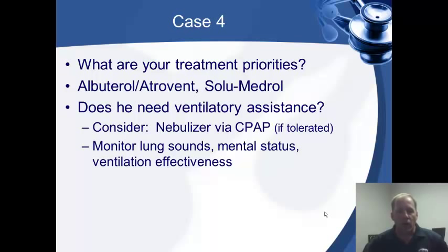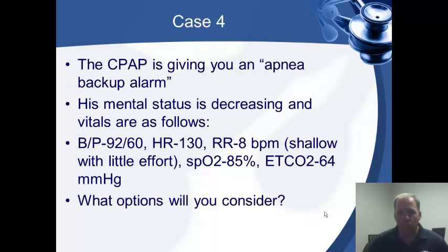You want to monitor lung sounds, mental status, and ventilation effectiveness so that we know whether we need to continue this treatment or become more aggressive. Once the patient's very tolerant of the mask, then we can strap it on their head and just continue to coach them while the mask is in place. So if the CPAP starts giving you an apnea alarm, what this means is that the patient's not ventilating themselves well enough and they are breathing slower than 12 breaths a minute.